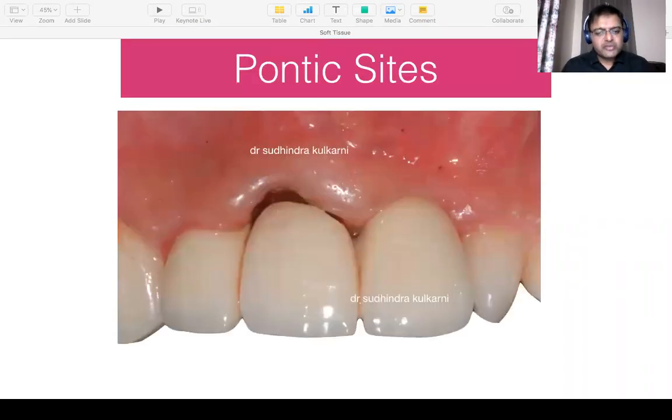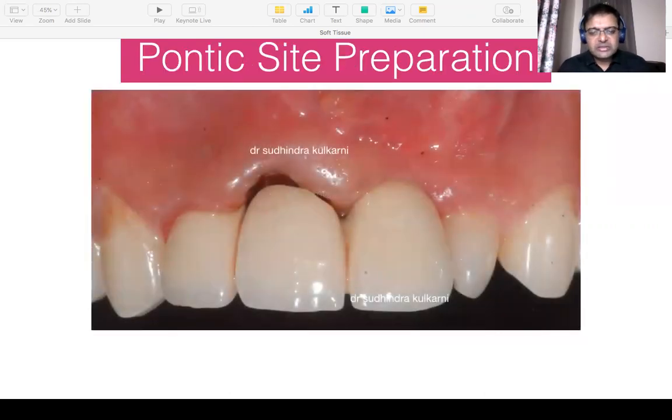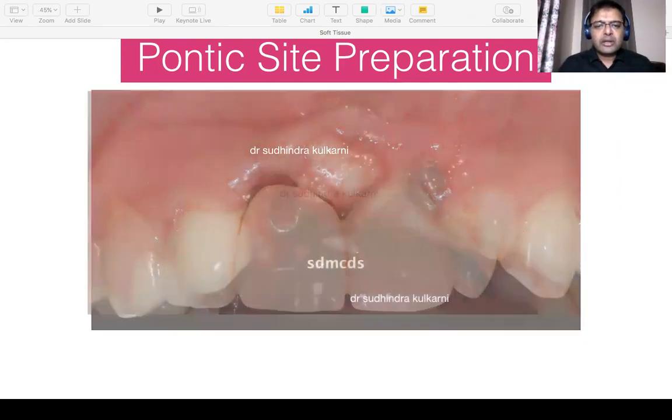Next, we move on to free soft tissue grafts. Free soft tissue grafts are those set of grafts which you remove from one area and graft it into the other. One of the most common areas where you will have to do a free soft tissue graft is when you have pontic sites. Okay, so let's look at this. It's a 3-unit bridge. The one is undergone a root submergence, but the tissue is not covered up. So how do we cover up this?